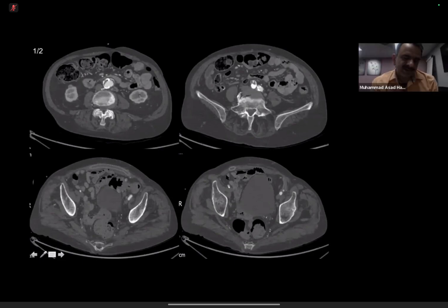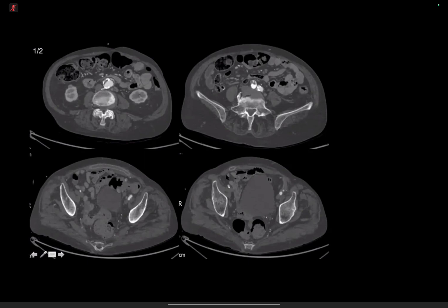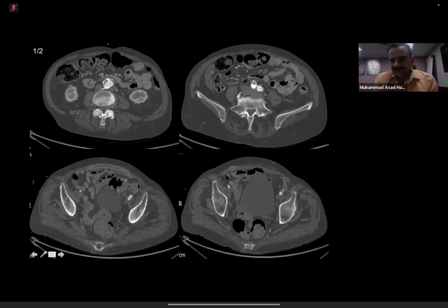I mean, obviously this patient has got poor vessels. She's old. She's still a smoker, and there is an occluded graft. As we discussed in the previous case, you don't do a thrombectomy and thrombolysis. It has to be thrombolysis. If failed, then thrombectomy. Okay, so that should be the order of the sequence of the things. Now, this patient is having, as I said, iliac to femoral bypass graft. How would you approach it?